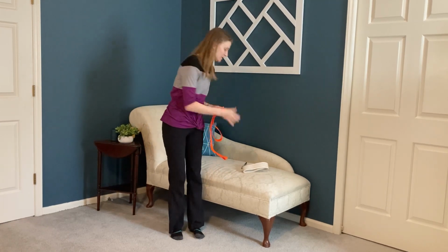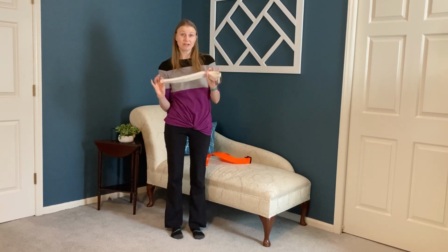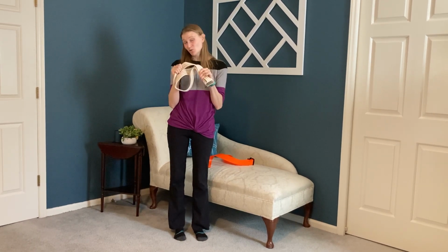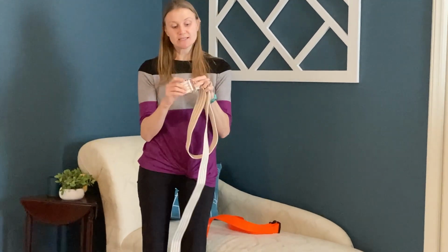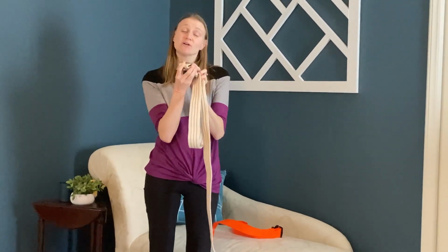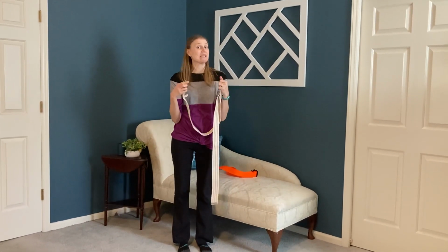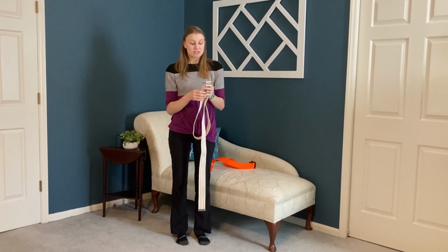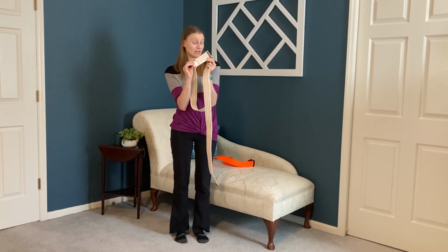What you're most commonly going to see is this canvas style gait belt. You might see these in an outpatient clinic or in rehab, or some clients have them in their home. These are not very easy to clean between clients, so usually these are a single-use gait belt. They have a metal buckle that uses these teeth mechanisms to tighten up. It is very important when you're using this canvas style gait belt to make sure that you have it on in the correct direction. If the gait belt is inside out or the teeth aren't facing the correct way, you're not going to get it very tight. So the first clue is finding the inside lining with the tag. You want that facing the patient. That's going to help you get it oriented correctly.